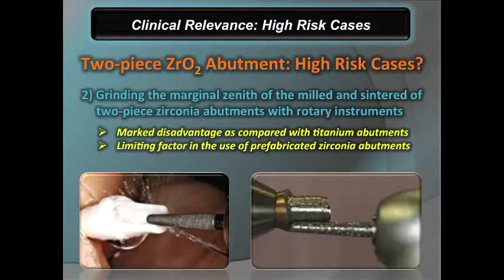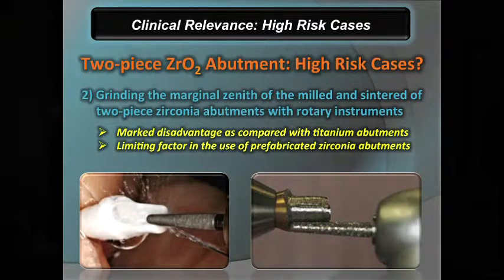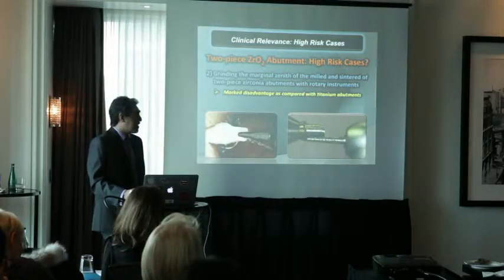So we have to make sure that the area on the margins are not going to be too much manipulated. That's the advantage of titanium. If you are grinding the margin, or your technician is grinding the margin in a titanium abutment, there won't be any problem.